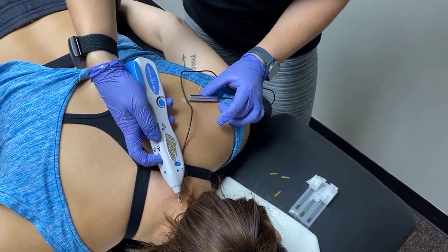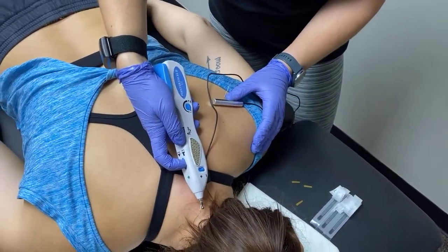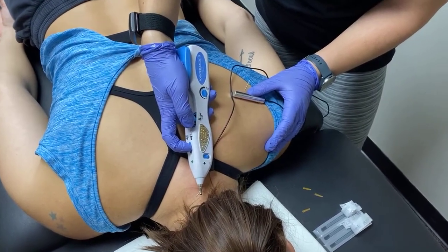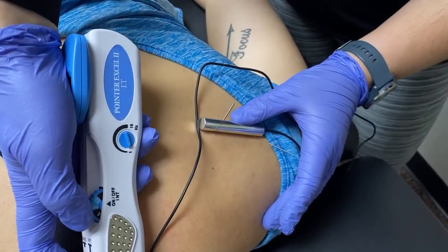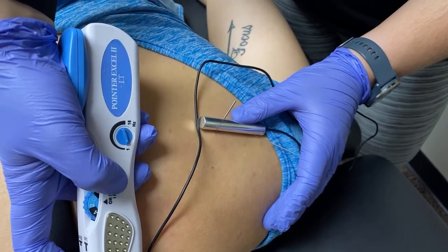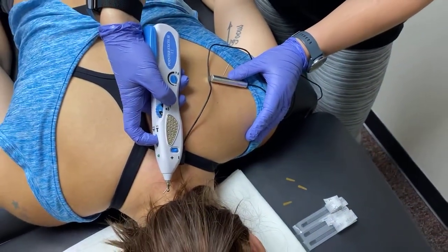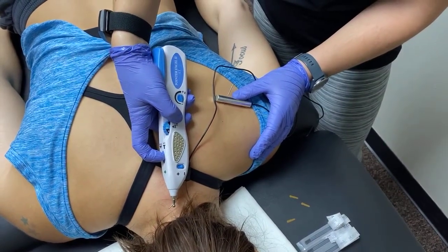I'm going to keep increasing it a little bit. Tell me when it feels kind of moderate, okay? Okay. Say that's kind of moderate. Okay. So then here, you can actually see that muscle contracting and those needles moving a little bit. This e-stim is just giving a little bit of pulse to that muscle because muscles actually run based on electrical stimulation. Like the muscle uses electricity, that's how it runs. The nerves send an electrical impulse to the muscle to turn it on. So you can kind of see it moving there.